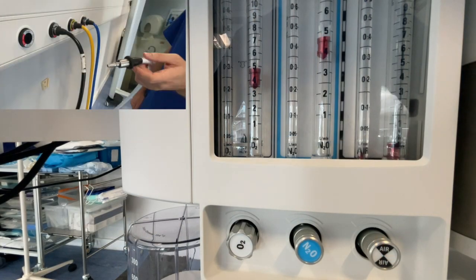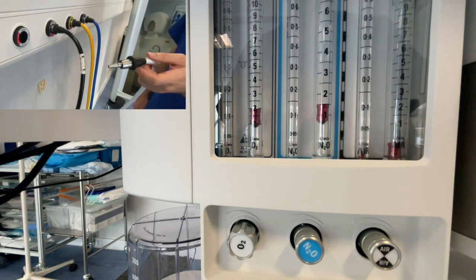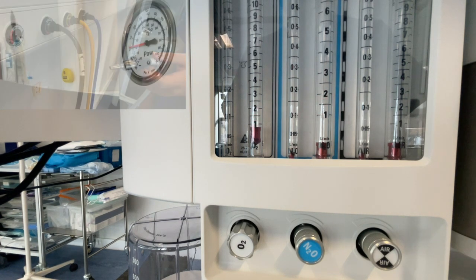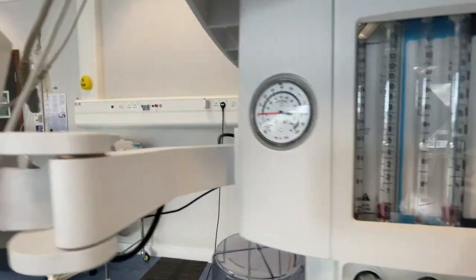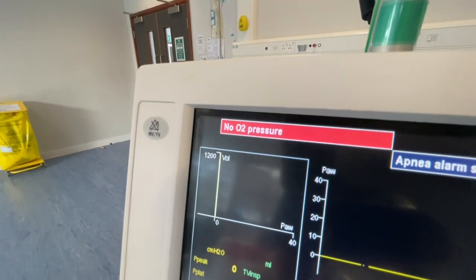If the oxygen supply from the pipeline were to fail, the supply of nitrous oxide should automatically shut off, and we can test this by unplugging the oxygen pipeline and watching the rotameters. Additionally, this allows us to test the oxygen failure alarm.